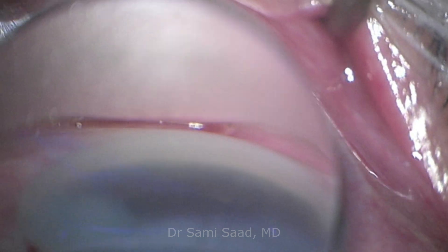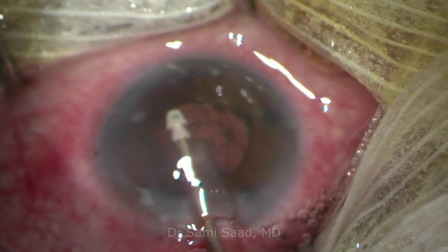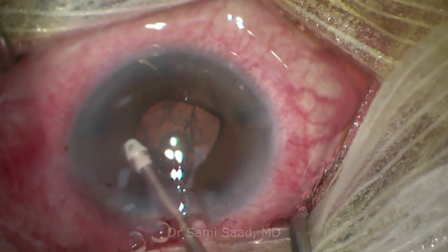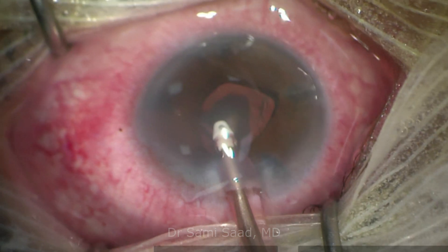we search for anterior iridocorneal synechiae that can be viscodissected if necessary. Finally, we perform hydrosuture of the corneal incision.